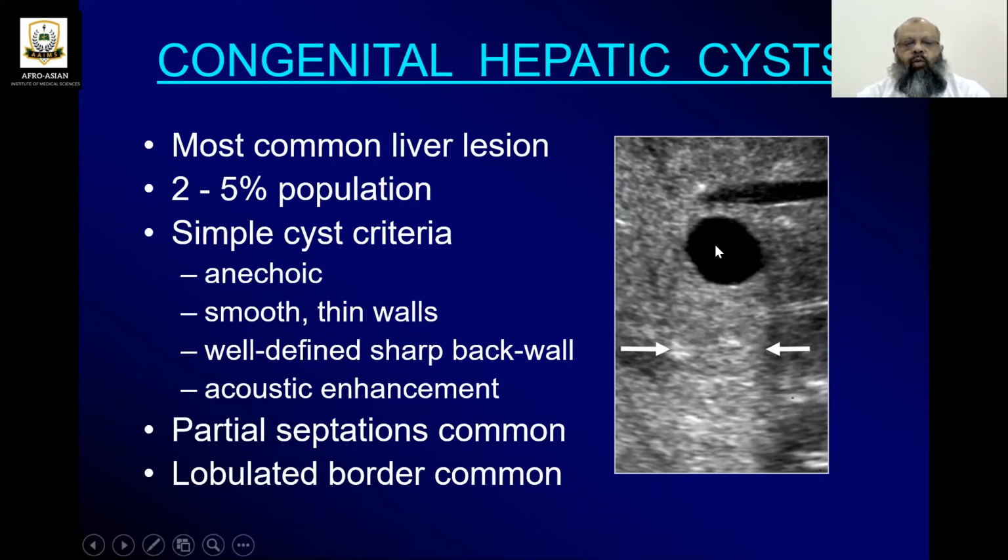This is anechoic, black, smooth, thin walls, well-defined, sharp back wall, acoustic enhancement. This is edge shadowing. So it is rounded, thin-walled, anechoic interior.